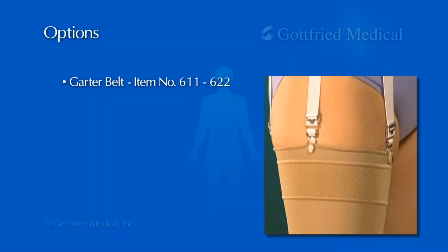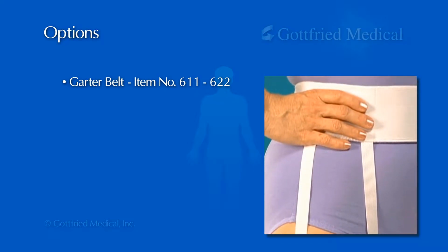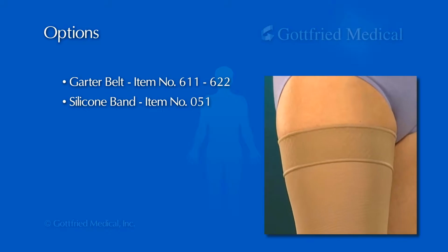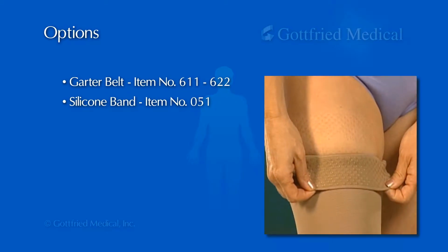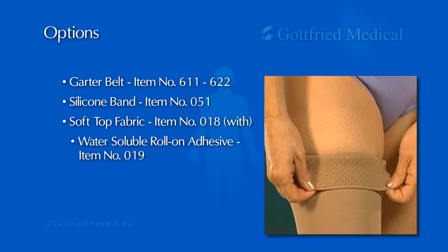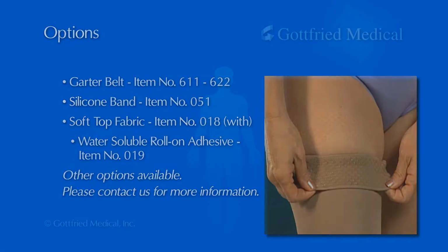A standard thigh-length support requires the use of a garter belt, so be sure to include a waist measurement on the order form. Other methods of holding the support in place include an optional silicone band or a soft-top cotton fabric used with water-soluble adhesive. Keep in mind that a silicone band tends to roll or curl on a heavy person. In such cases, we recommend using a roll-on adhesive.